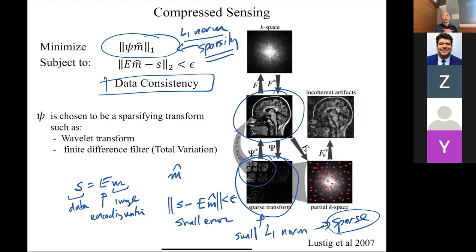Yeah, go ahead. How is it different from downsampling? With downsampling, if you downsample an image, for example, then in this case, with this wavelet transform, I'm getting rid of, say, 80% of the coefficients, right? What would happen if you got rid of 80% of the voxels in that image? It wouldn't look very good. Right. So it's basically saying you're going to a domain where you're much more efficiently representing the image.